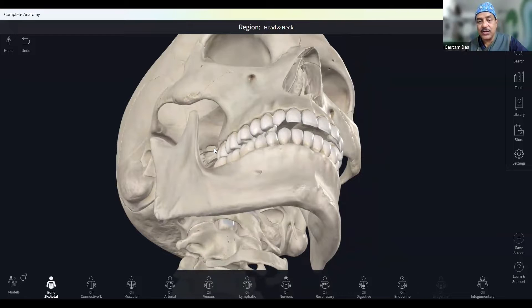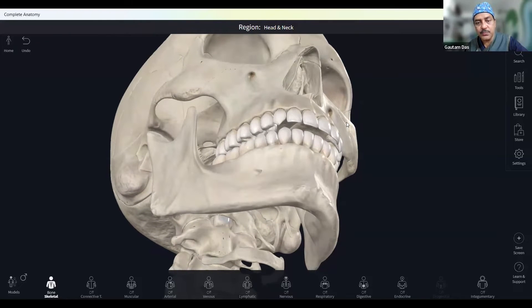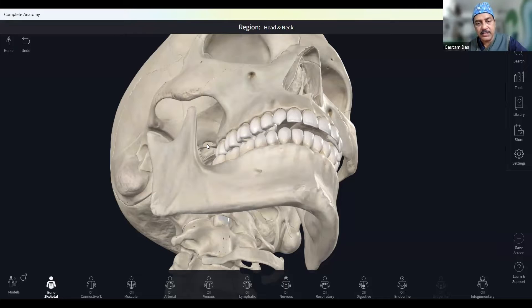That is the axis. You cannot enter the Gasserian Ganglion through the foramen rotundum or through the superior orbital fissure. Your axis to reach the Gasserian Ganglion is only through the foramen ovale. You need a caudal tilt and also need to look from the opposite side — either turn the head or make an ipsilateral rotation of about 15 degrees. Once you have this view, use tunnel vision to find and reach the foramen.